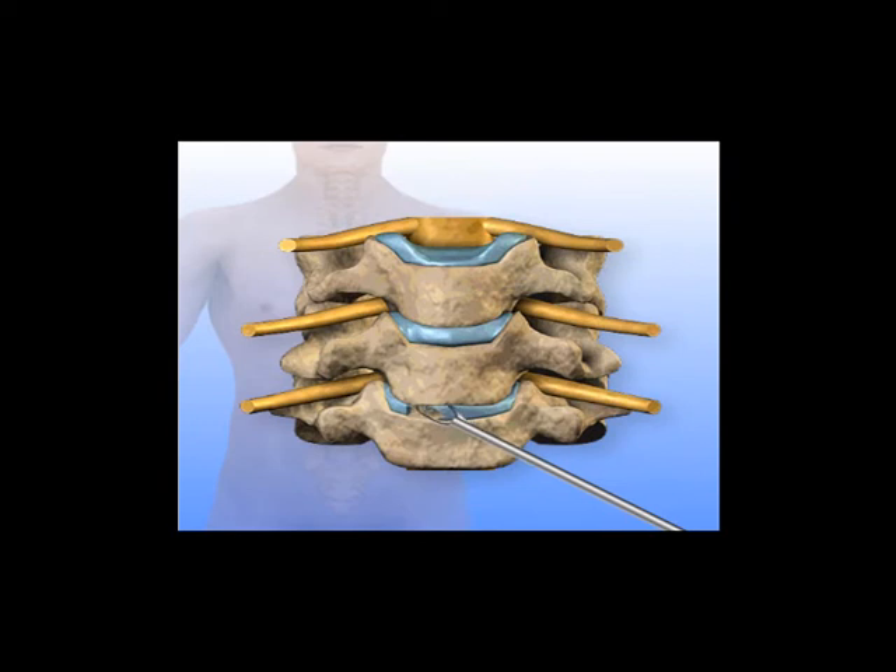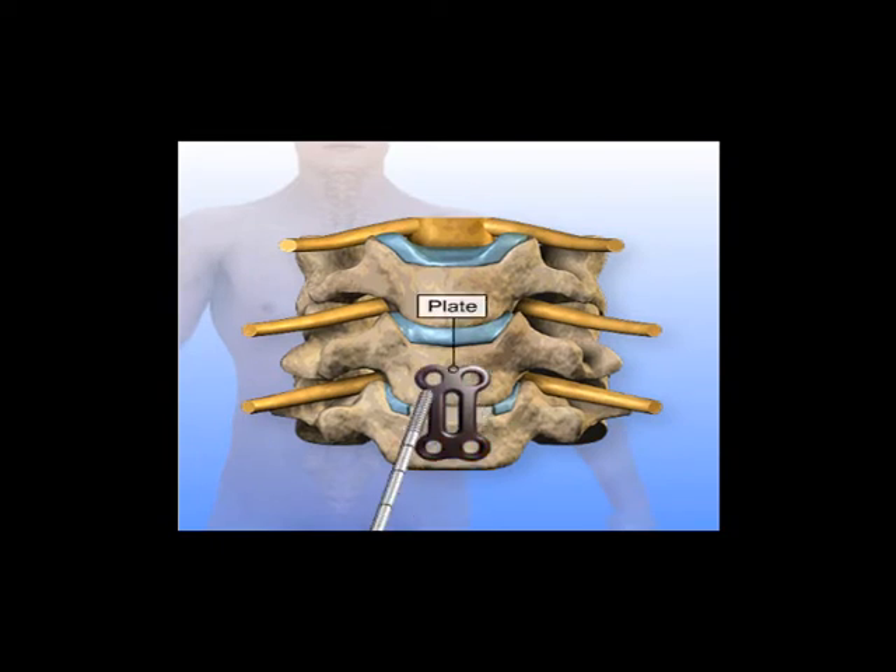After disc material is removed, a bone graft is cut to the correct size and placed in between the vertebrae to add stability. A metal plate is placed over the bone graft and two holes are drilled in each vertebra. Four screws are placed through the plate to secure the plate to the vertebra.